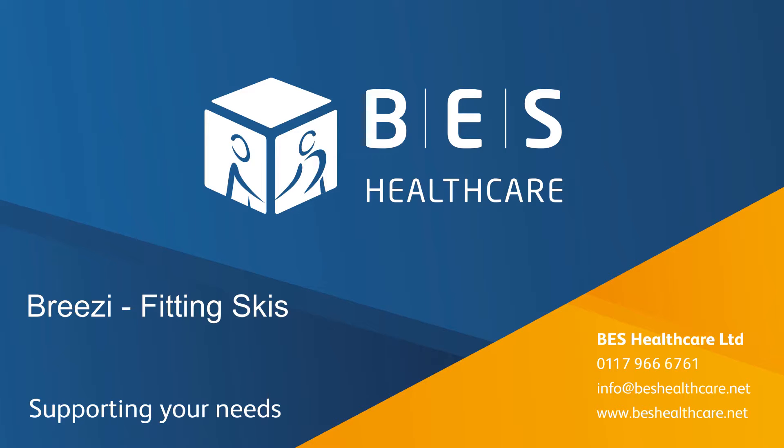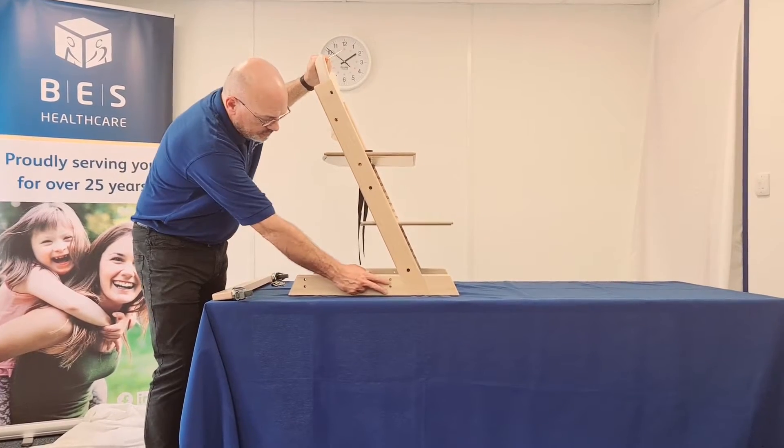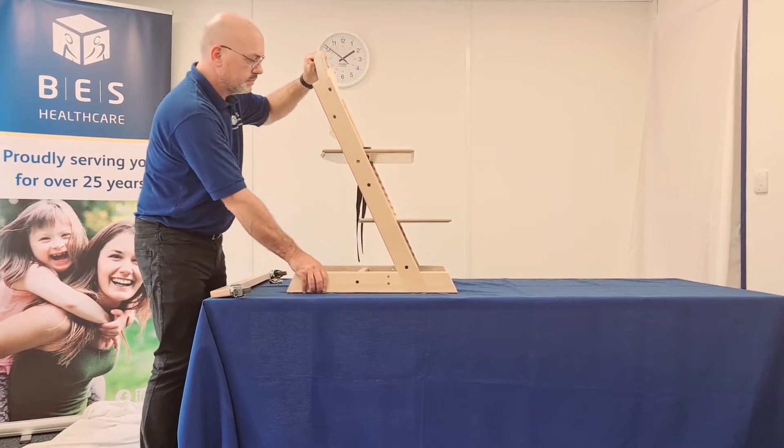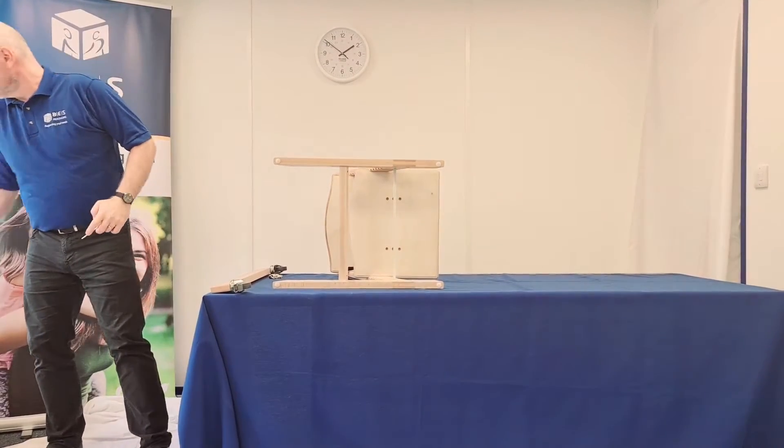Welcome to the instructions for fitting skis to your Breezy. Your Breezy should come with mobile frame attachment holes pre-drilled. If your Breezy has plastic feet fitted, carefully remove them with a prizing tool.